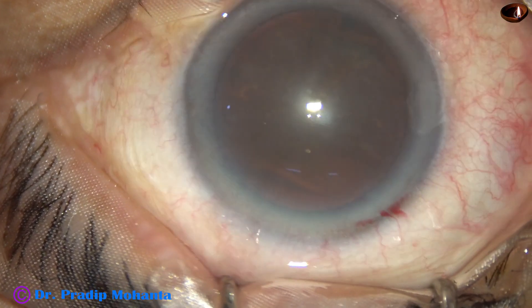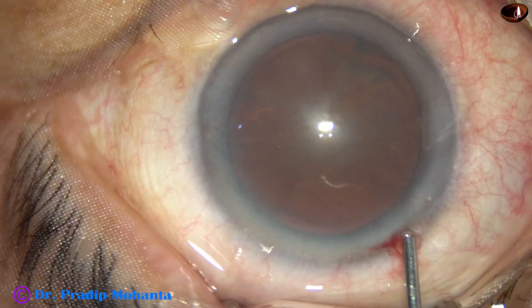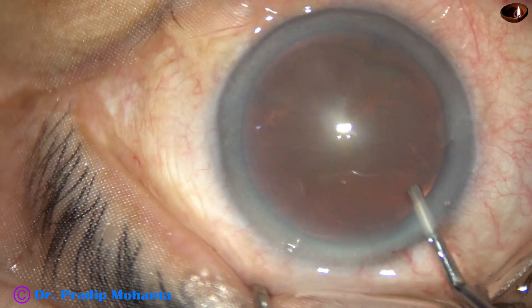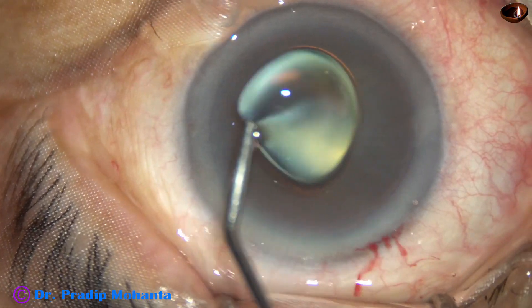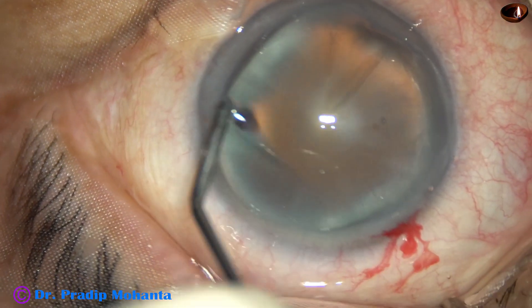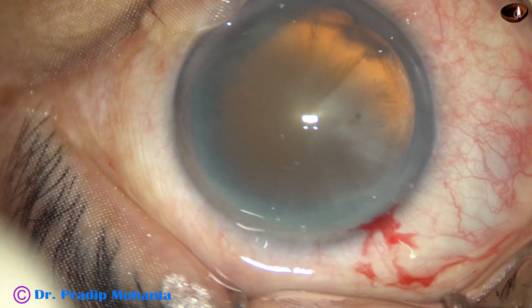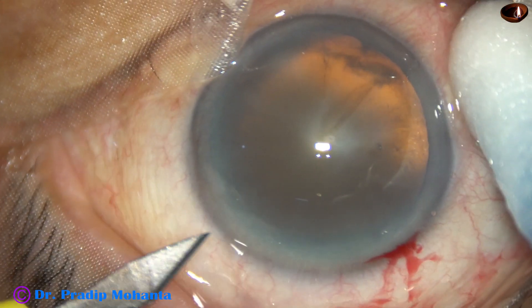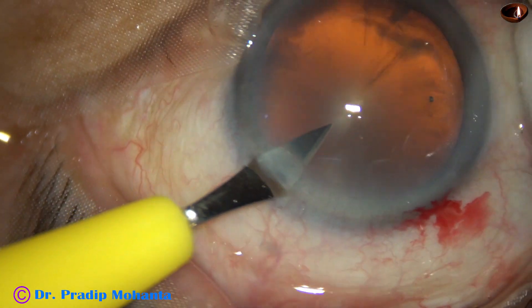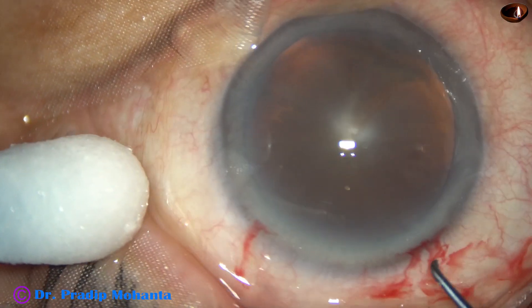This is phenacaine. Now the anterior chamber is filled with 2% hydroxypropyl methylcellulose. Methylcellulose is applied over the cornea for better visibility. A side port is made about three clock hours away from the main wound on the left side, and only one side port was made in this case.